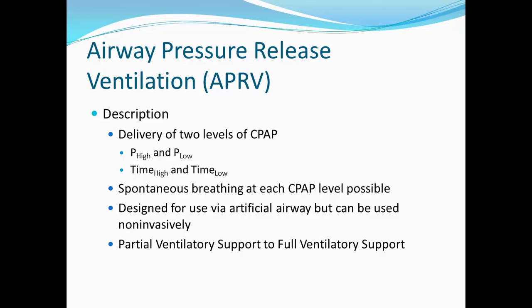We'll allow the patient to breathe spontaneously at the T high and theoretically also during T low. However, usually the T low is set so short there's not enough time for the patient to breathe spontaneously. Therefore, really the patient's breathing spontaneously only during time high. It's designed for use with artificial airways. However, some people do use it for non-invasive ventilation as well.